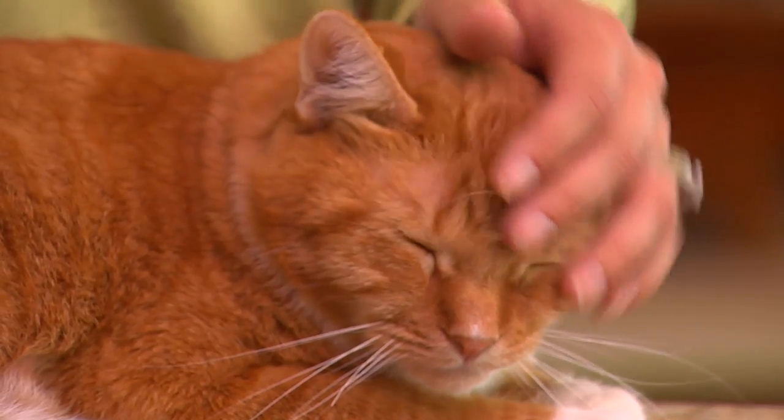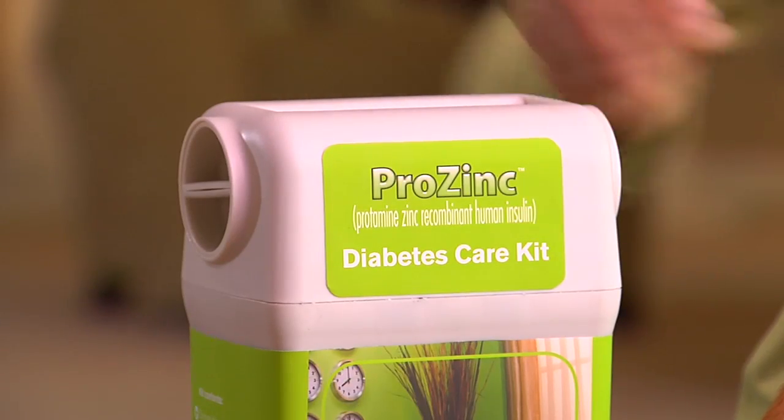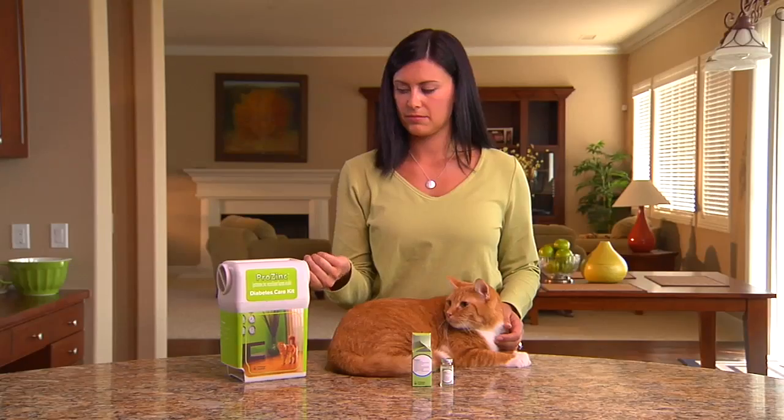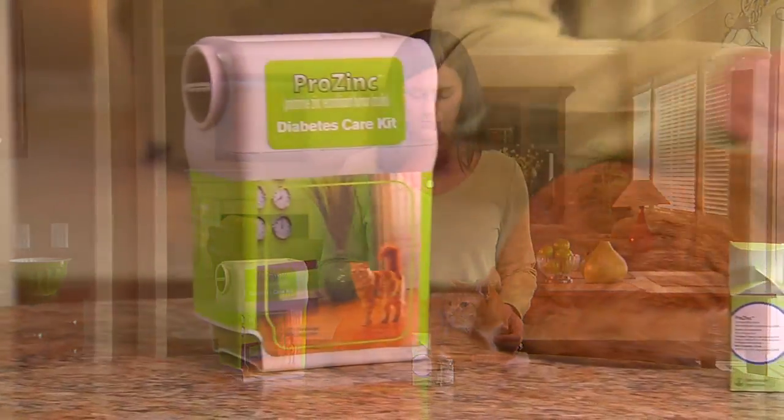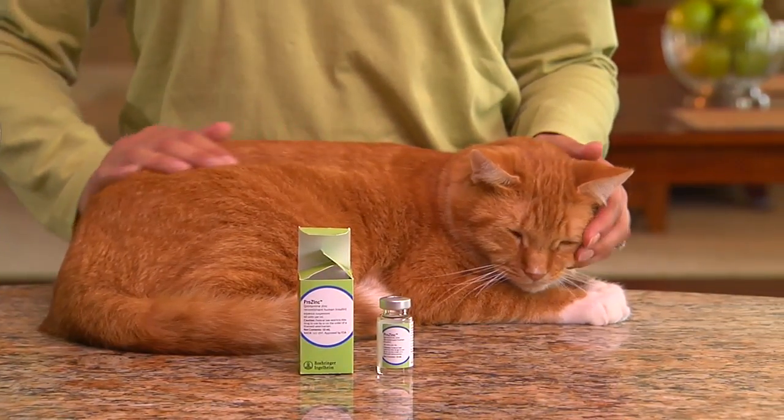Now reward your cat with more petting. You'll need to dispose of the used syringe in an appropriate container. If you don't have a syringe disposal container like Lisa's, ask your veterinarian for an alternative option and be sure to dispose of it according to local regulations.